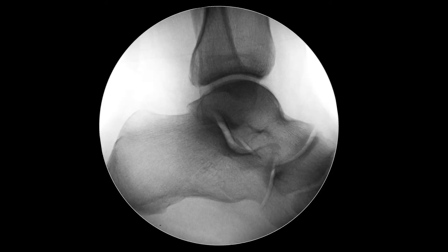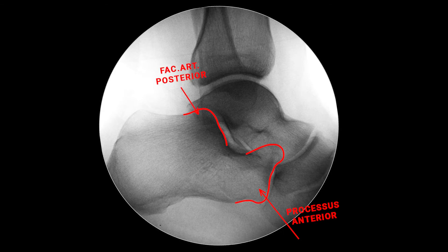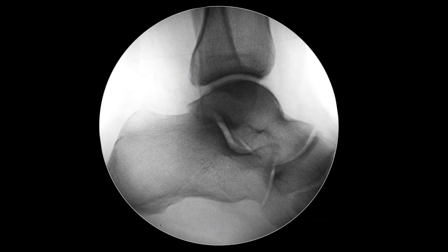At the lateral view we can clearly see the anterior process of the calcaneus, the posterior articular facet, and the calcaneal tuber. The sustentaculum tali is projected onto the sinus tarsi region. At the lateral view, the orthopedic surgeon can find the following traumatic changes.